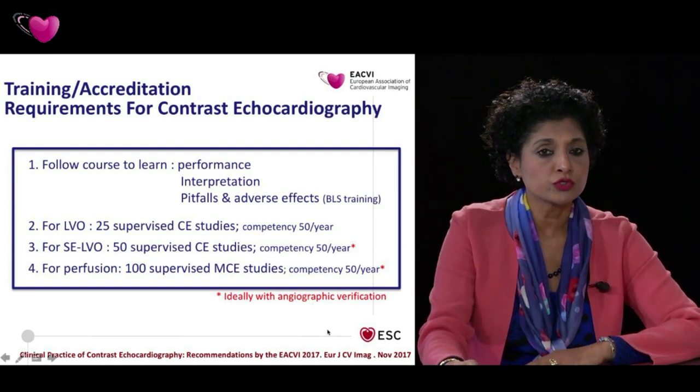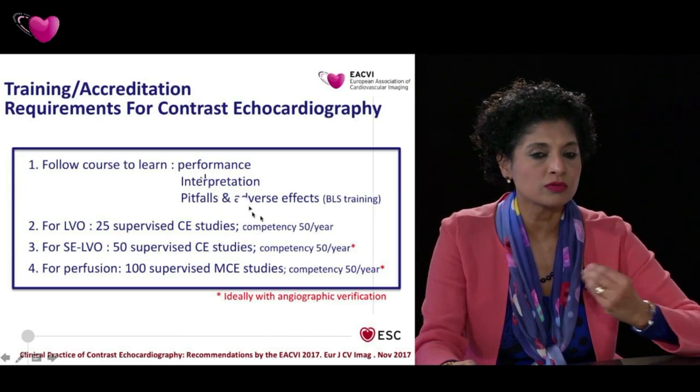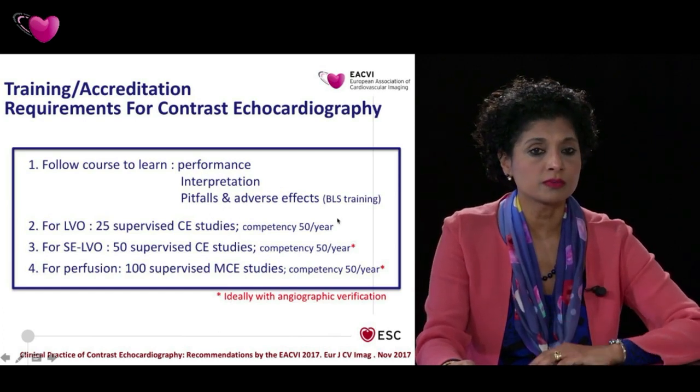The EACVI recommends the requirements which are necessary for optimum use of contrast in your echo lab. You should learn how to perform the contrast studies, how to interpret them, and you should also realize what the pitfalls and the adverse effects are. Adverse effects meaning the possible side effects.